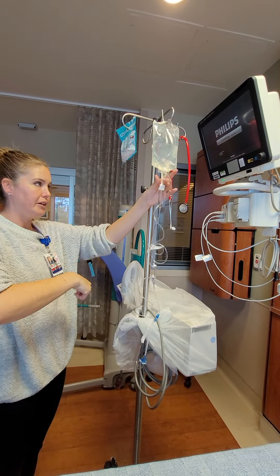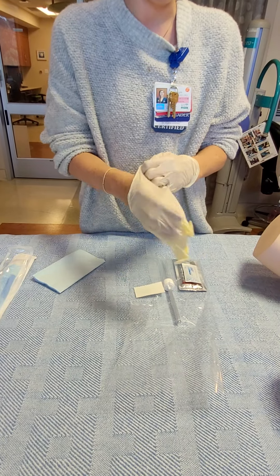Once your patient is prepped and ready on the table, go ahead and take out your cath kit — I like it because it already has all your supplies in there. Try not to judge too harshly on my sterile technique right now, as I'm not with a patient. Go ahead and don your sterile gloves. You're going to keep this as a sterile procedure just like you would with any other urinary cath.